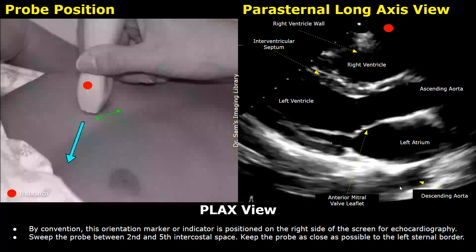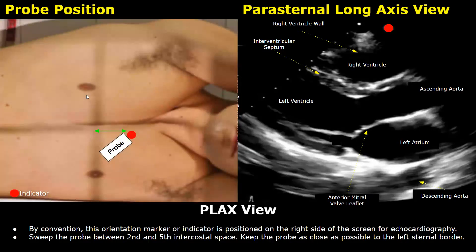Here is another image showing the probe position with the patient lying in supine position, with the indicator directed towards the patient's right shoulder. The left lateral decubitus position brings the heart closer to the ribs and moves the lungs away from the parasternal window. So if you are having trouble finding a good image with the patient in supine position, switching to a left lateral decubitus position can be helpful.